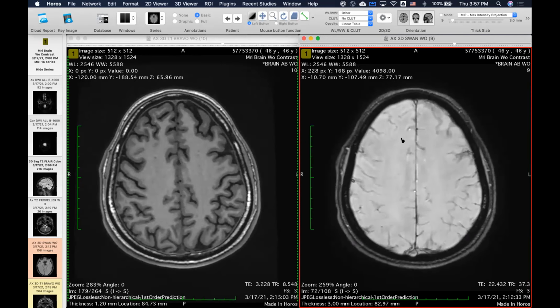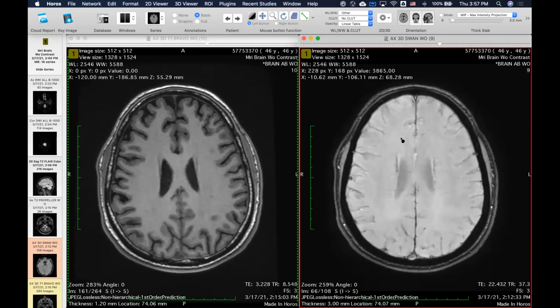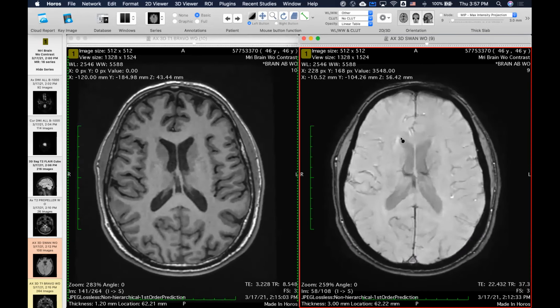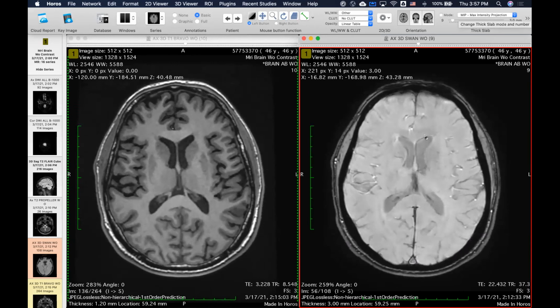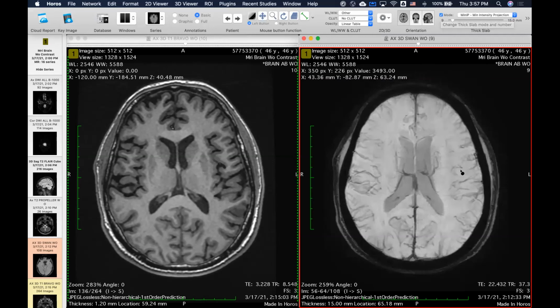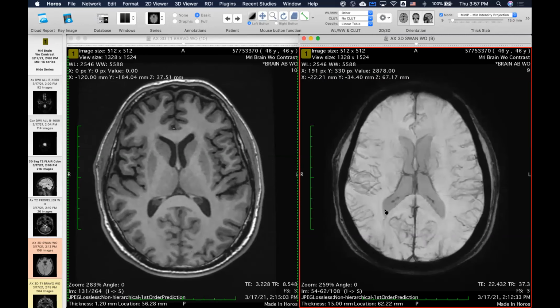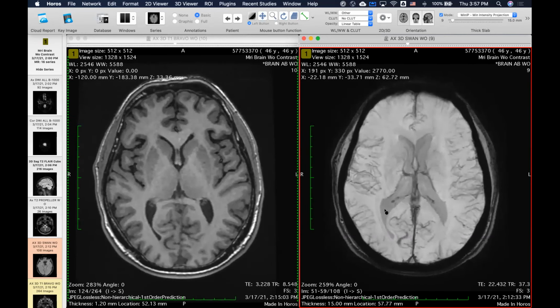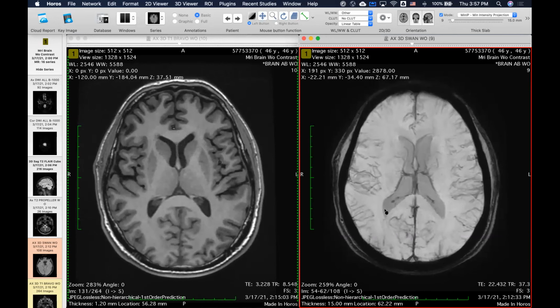It's actually a combination of the magnitude image and the phase. But the way that people actually process it, they look at it slightly differently. So they actually do a minimum intensity projection across a few slices. So I can actually do that for you. Here's the minimum intensity projection across 9 slices, and now you can see the veins. So it emphasizes basically what is the minimum value across a few slices.